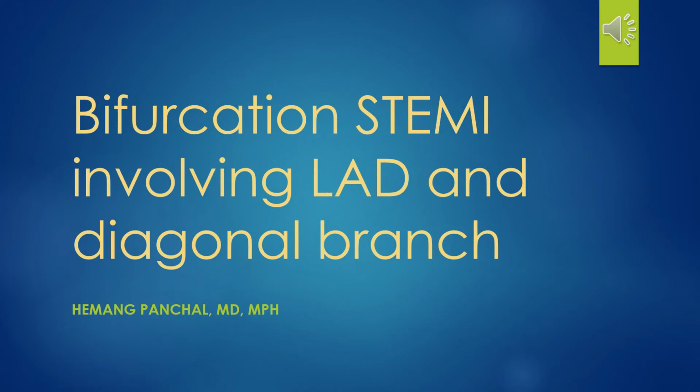This is Hemang Panchal. Today we are discussing a case on bifurcation STEMI involving LAD and diagonal branch.